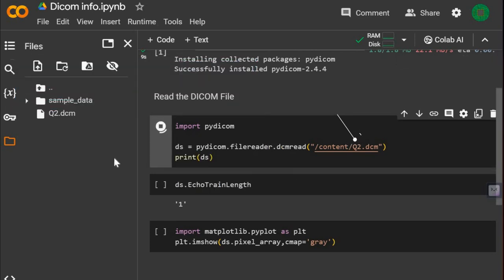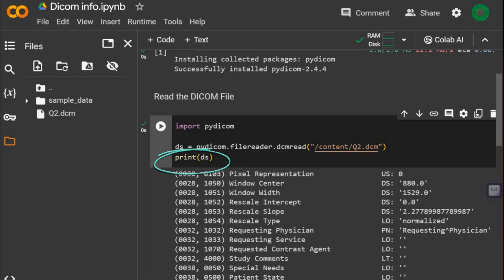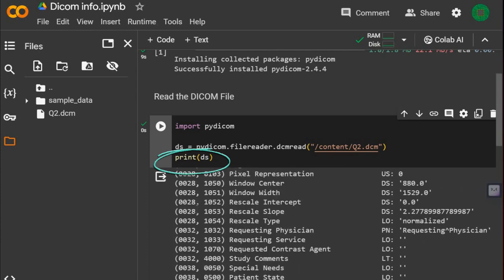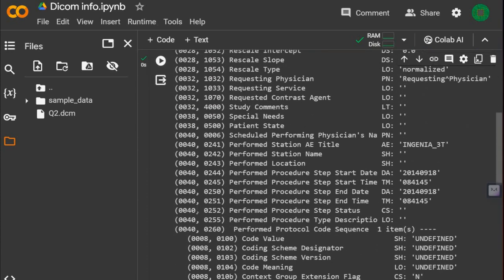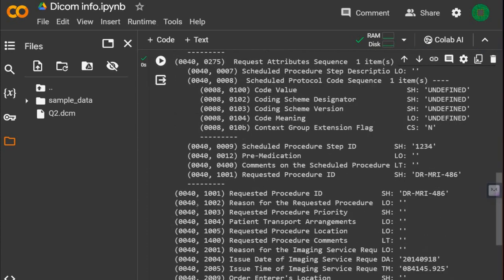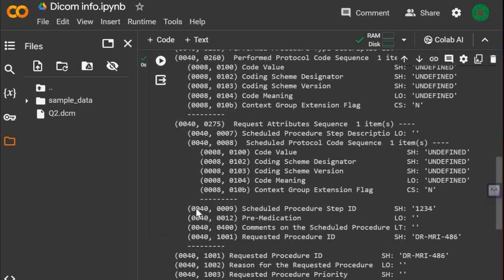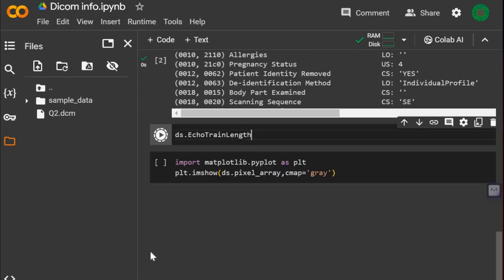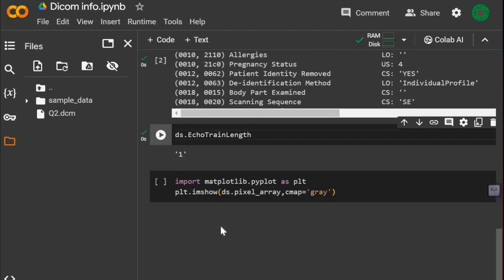When we run the cell, the entire DICOM data is now stored in the variable ds. ds has all the metadata info and the image data. To get a specific field of the metadata, we can check ds followed by the field name.